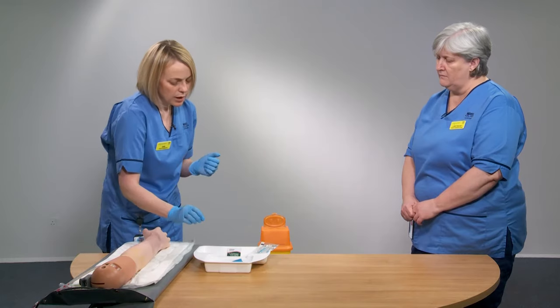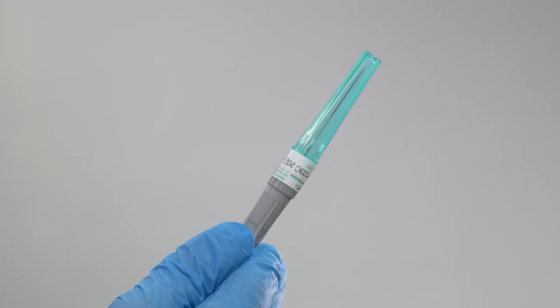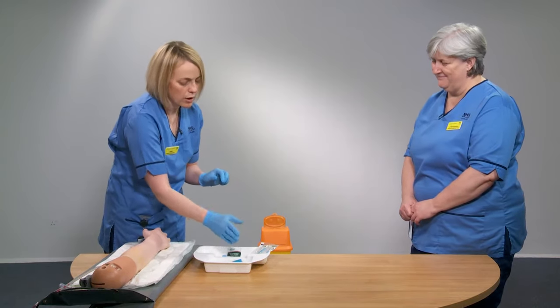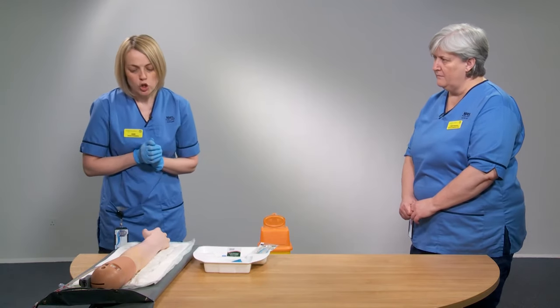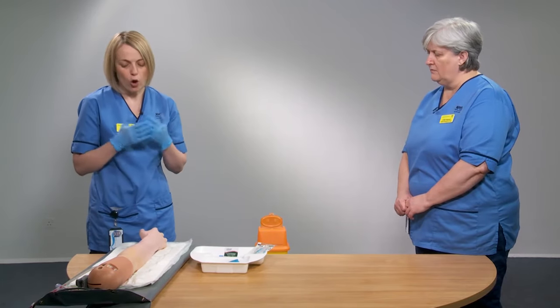The quick shield is a slightly different device. You'll need a quick shield holder, the needle, a blood bottle, something to clean the skin with, a tourniquet, and a gauze swab. We'll now demonstrate the butterfly needle first.